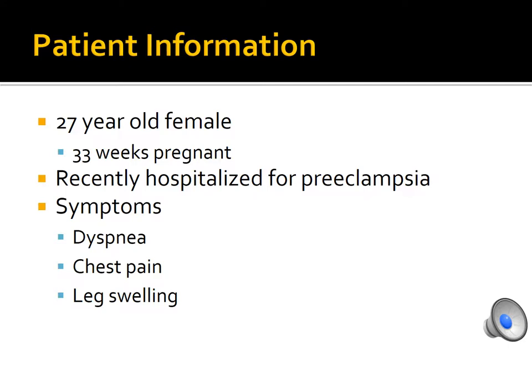Now, this is where we end up meeting the patient, when they come down to the imaging department and we begin a workup for a possible pulmonary embolism, which is what they're going to be looking for.